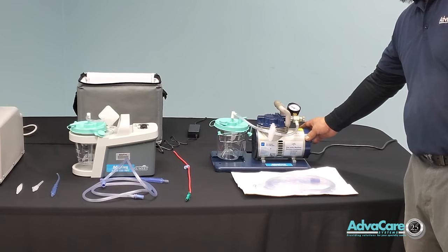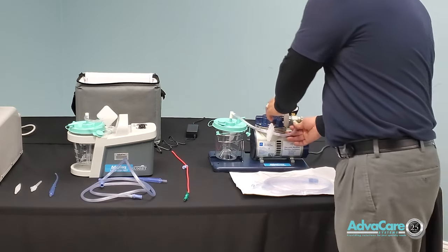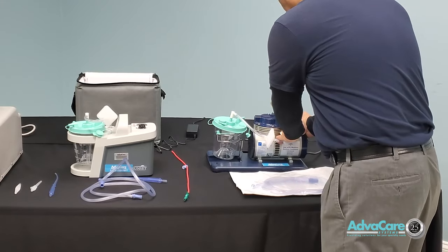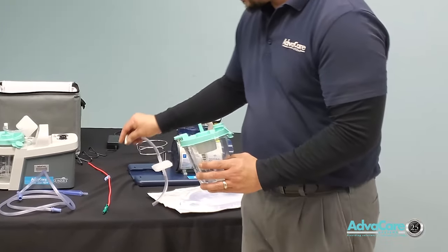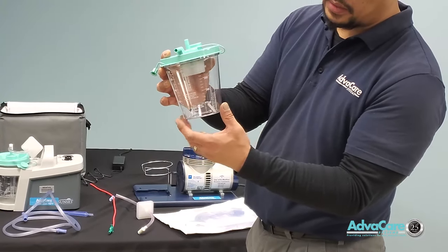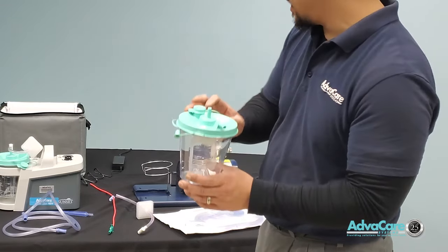Whenever we are going to set up a suction machine for proper use, you would always have a canister for fluid collection. You always want to inspect the canister itself for any type of visual cracks. Any type of visual cracks may cause an air leak.